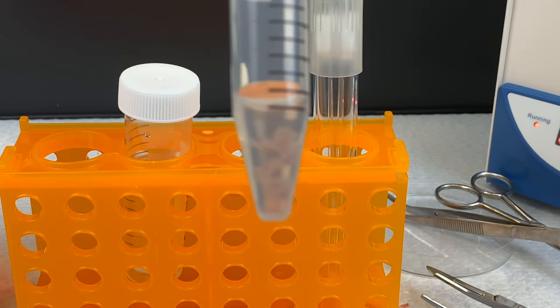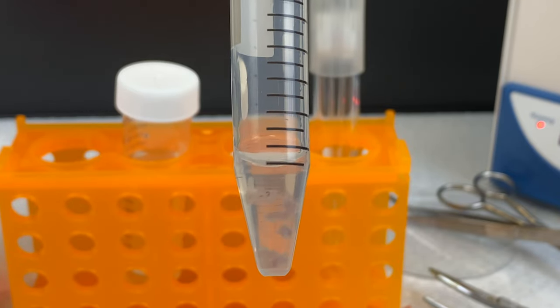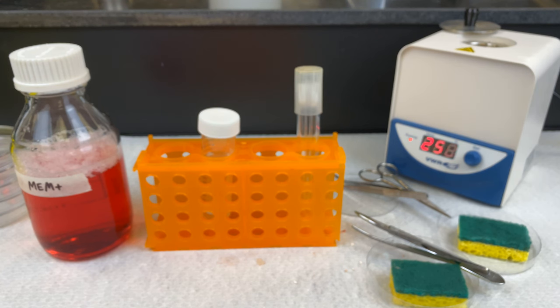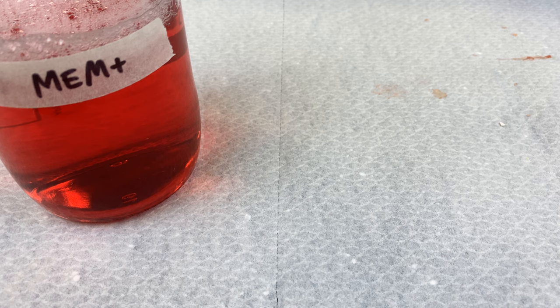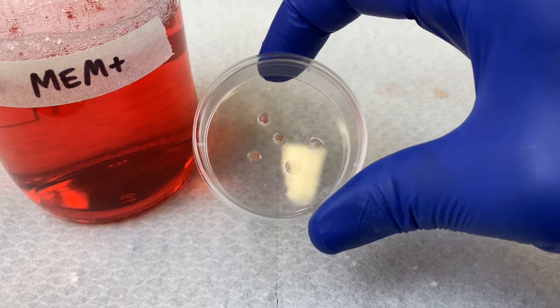We're going to place this at 4 degrees until our next lab. During this time, the trypsin will not be active — it only activates at 37 degrees. During that time, the trypsin will infuse into the tissue. We will then incubate in a 37-degree water bath to activate it.